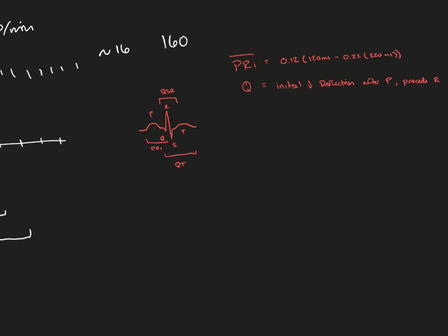So the Q wave, you have septal Q waves, which are normal variants. And this is like Matu level stuff that you don't really learn in paramedic school. But septal Q waves are essentially small downward deflections in 1, AVL, V5, and V6. And this is kind of 12 lead stuff, but we're just going over this.